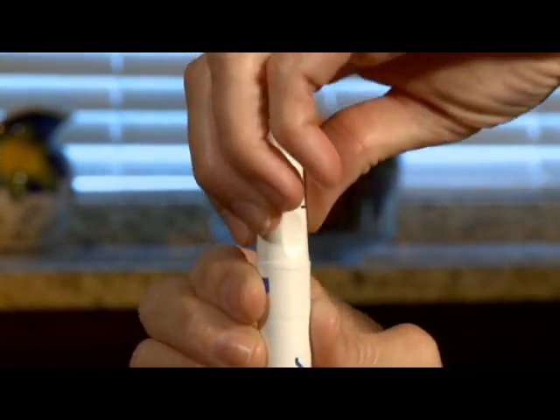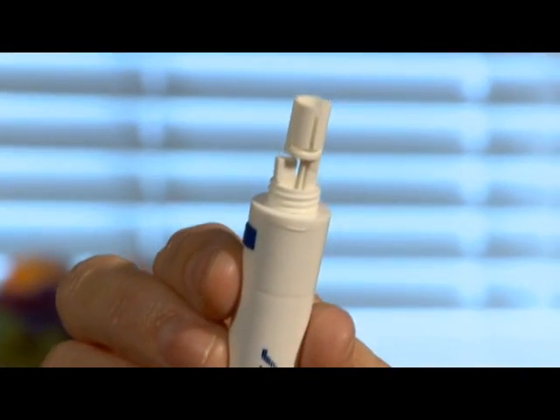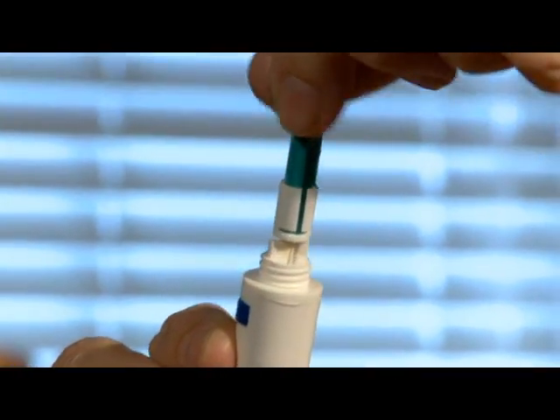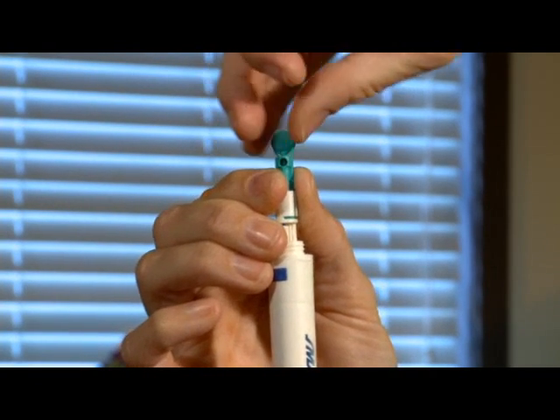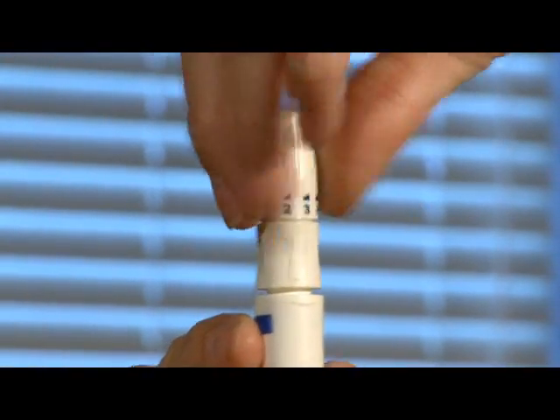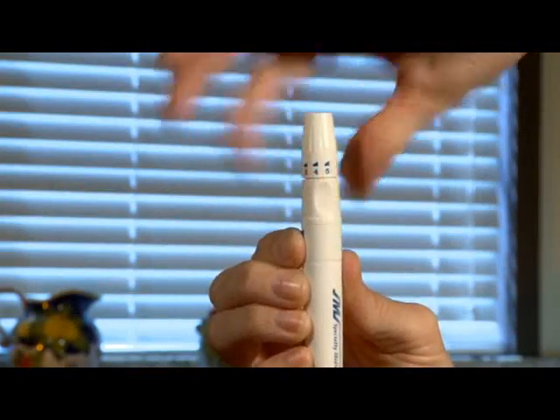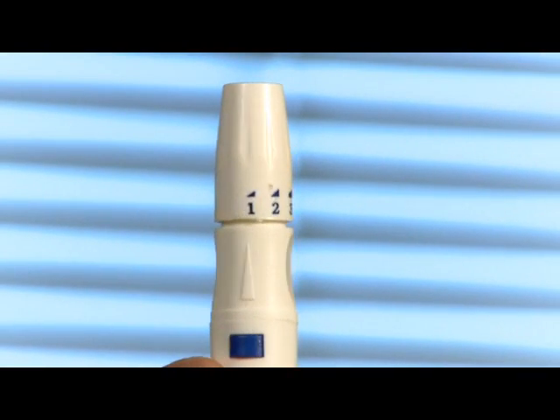Holding the lancing device, unscrew the top of the device and insert a new lancet into the device. Next, twist off the top of the lancet and remove it. Replace the top of the lancing device and adjust it to the proper comfort level for testing.